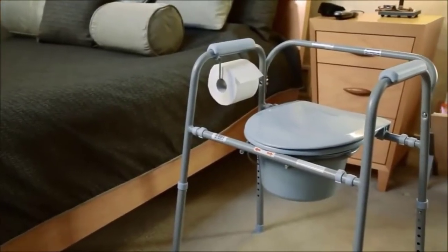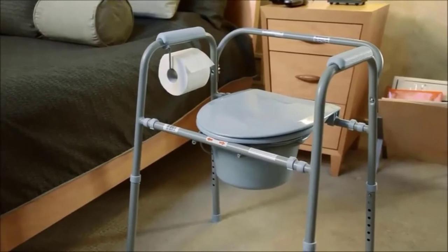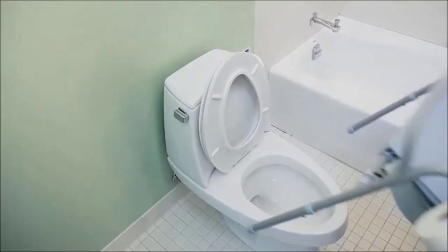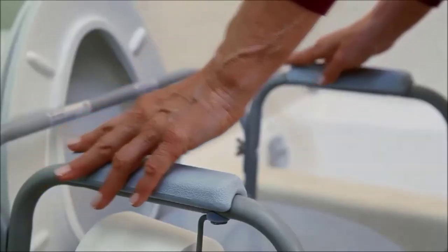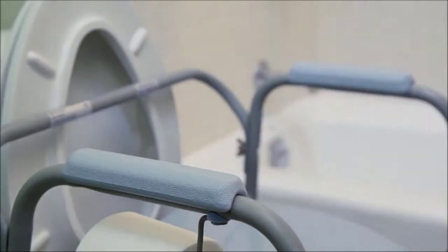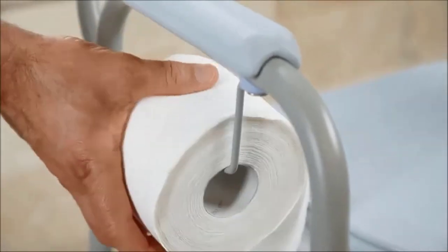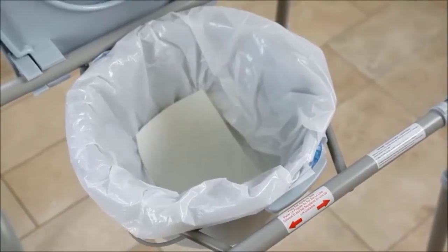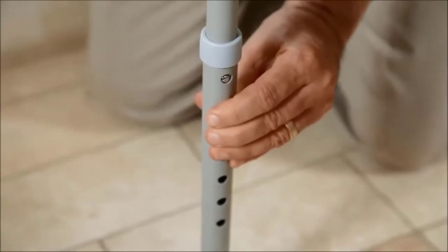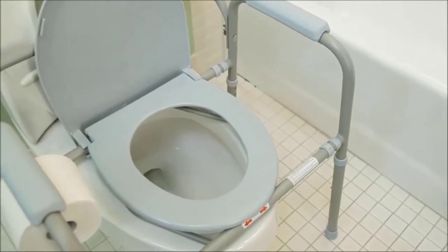The 3-in-1 commode is ideal for those who may not be mobile enough to walk to the bathroom. It can also be used in the bathroom as an elevated toilet seat or as toilet safety rails when combined with most standard toilets. It includes a toilet paper holder, and optional commode liners offer hygienic and easy cleanup. The height can be adjusted with the push of a button and it supports up to 350 pounds.